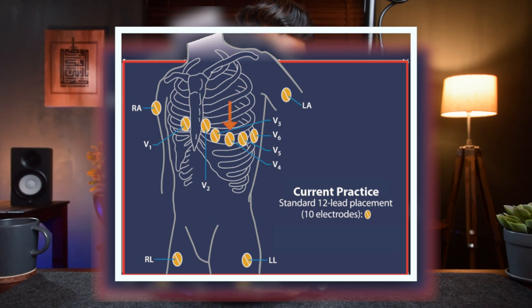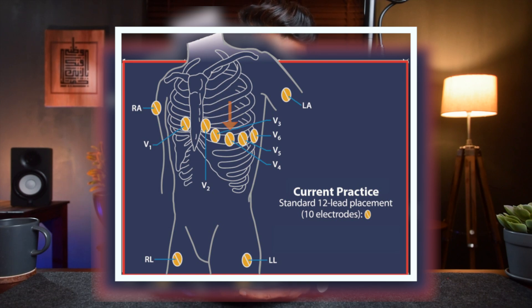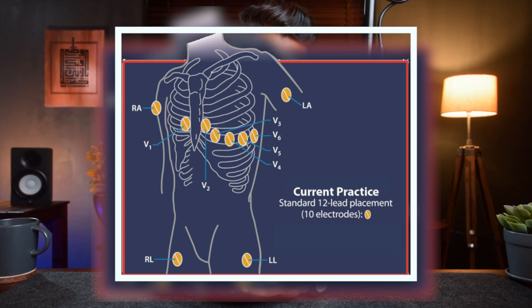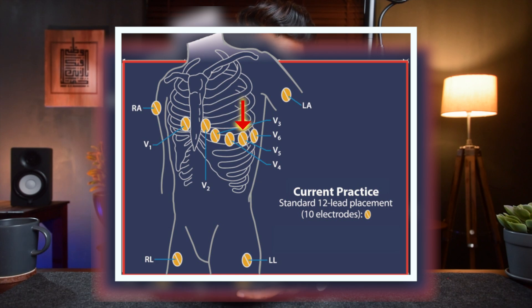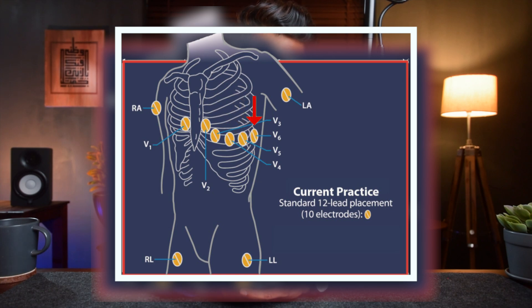You don't place V3 first; rather, you place V4, which is at the 5th intercostal space in the mid-clavicular line, and then you place V3 in between V2 and V4. V5 is placed at the 5th intercostal space at the anterior axillary line. V6 is placed at the 5th intercostal space in the mid-axillary line.